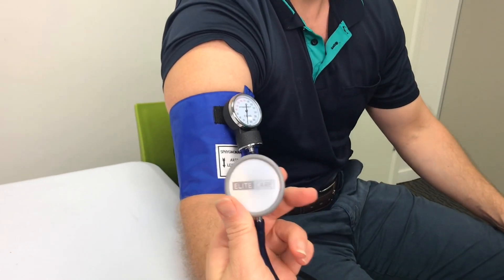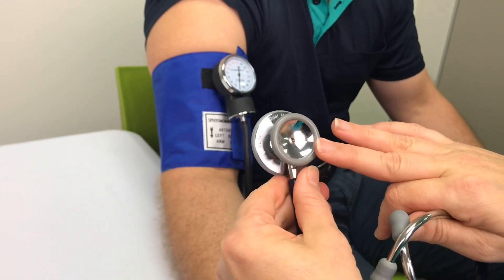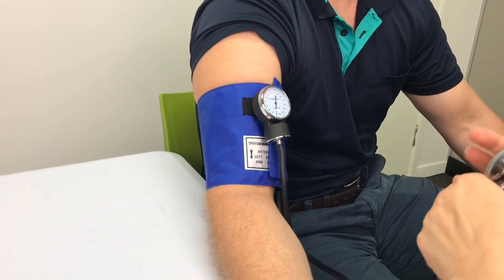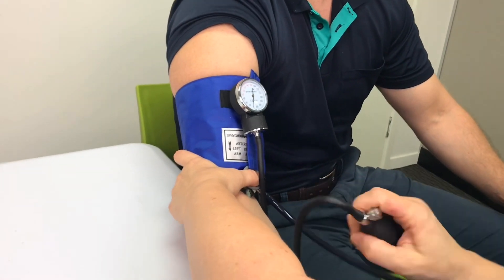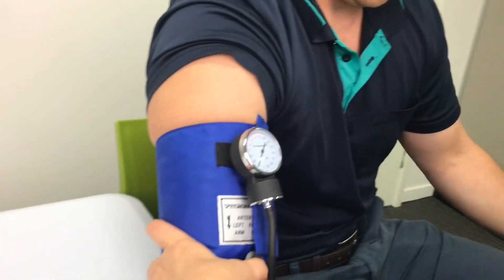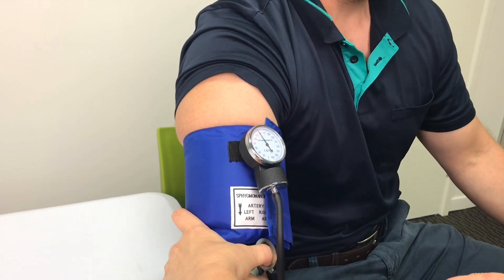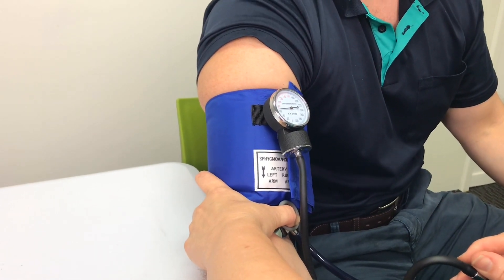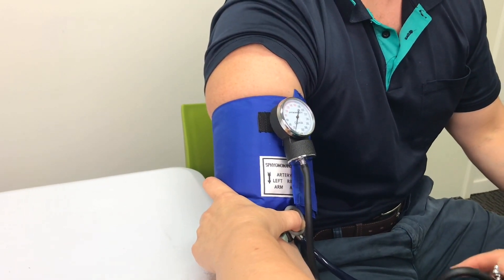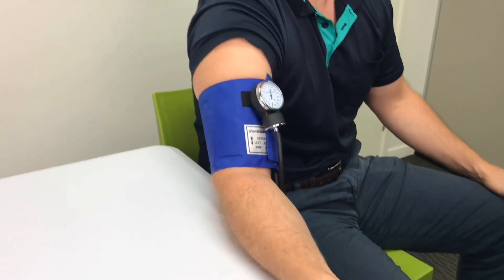You can use either side of the stethoscope — the diaphragm or the bell. I personally use the diaphragm side but some people prefer the bell. Make sure your valve is closed nice and tight, pump up to about 150 to 160, then really slowly release. I can hear the systolic sounds first come in, then go a little bit faster, and then completely release once the sound disappears.